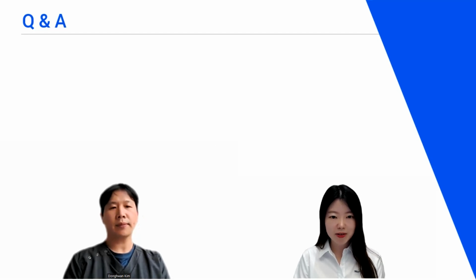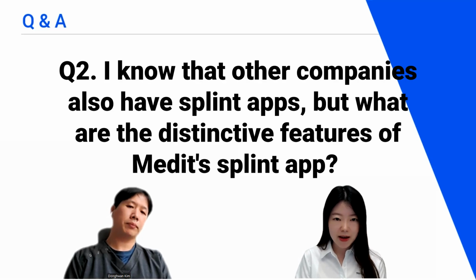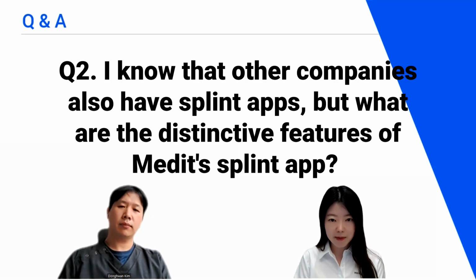Okay, question number 2. Is it easy to use the Medit Splint app? I know that other companies also have Splint apps, but what are the distinctive features of the Medit Splint app?